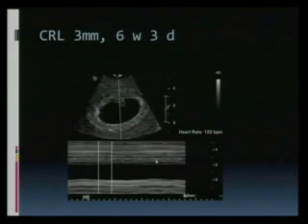Yes, Aaron. These 2 cardiac cycles, if you measure 1 cardiac cycle, will you get half the number or will it give you an error? No, it is just machine specific and I really can't answer that question. Why? All the machines I was used to take 2. So on the ones that measure 2, do we put? No, we don't do anything. When you measure 2, it will give you the correct measurement. Yes, you skip 1. You're measuring 1, skipping this one, and putting the second line here. Okay. Skipping 1. Dr. Simoncini, do you have an explanation?